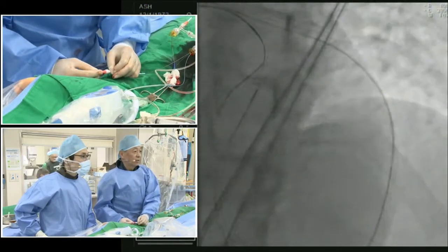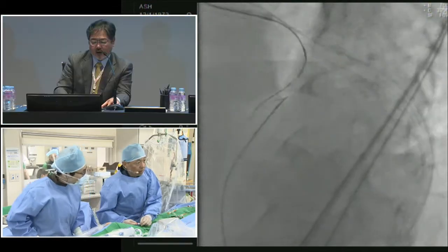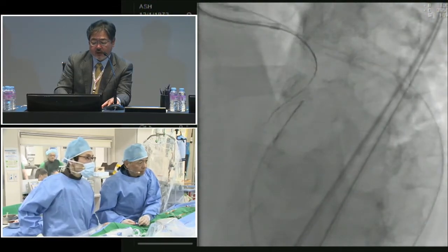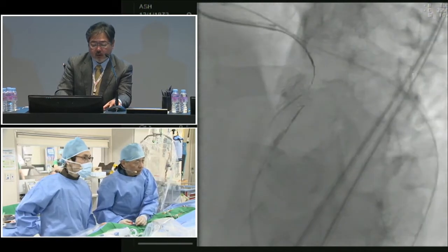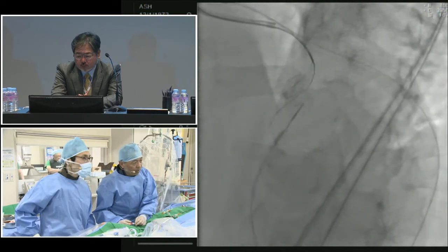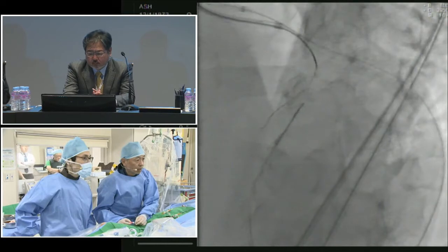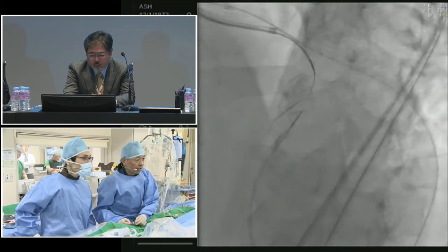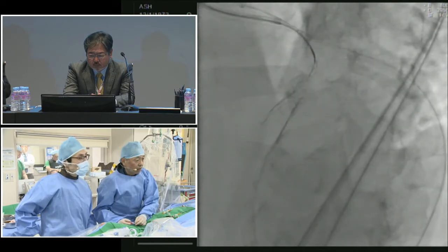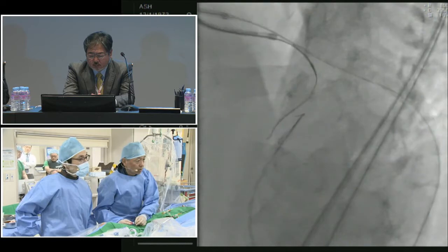Yasumi Sensei? This is Yasaka speaking. We didn't want to check the IVUS of the wire entry point at this timing? Yes, but I want to advance a little bit more distal because the guide wire position is not stable yet. Of course, I will check soon.